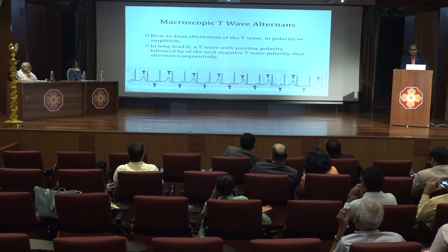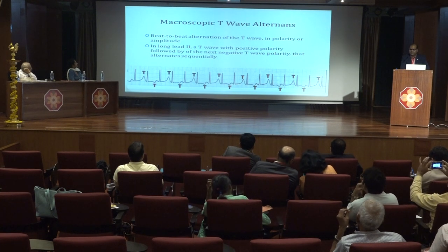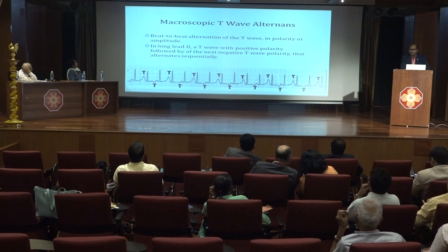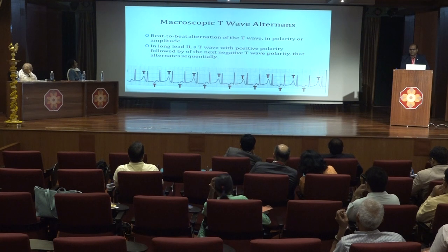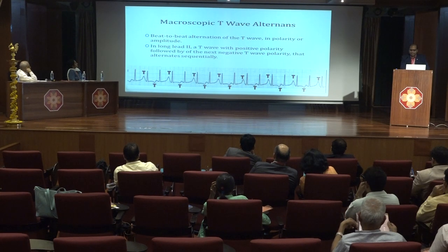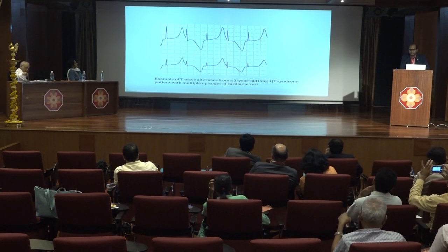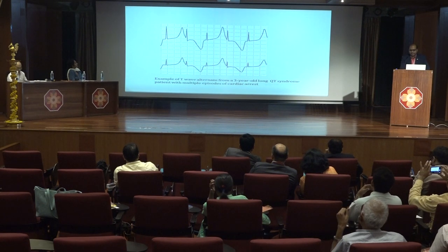Macroscopic T wave alternans is a characteristic sign of long QT syndrome, characterized by beat-to-beat variation in T wave polarity and amplitude. It may occur briefly at rest but is usually associated with emotional stress or physical exertion and may precede torsades de pointes. In this long lead II, we see alternating positive and negative T waves. Another example from a 3-year-old child with multiple episodes of cardiac arrest also shows alternating positive and negative T waves.